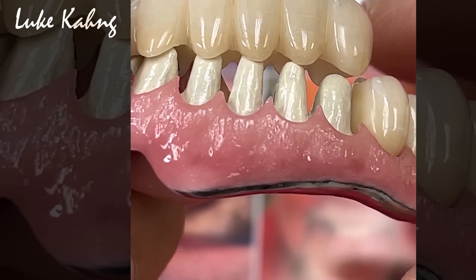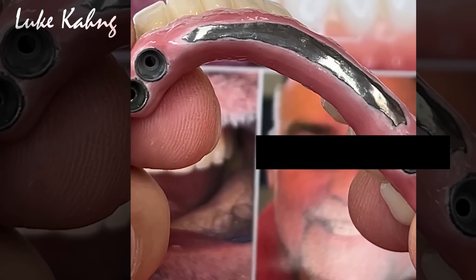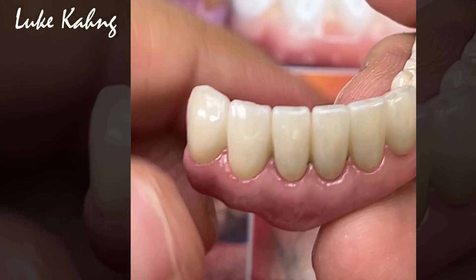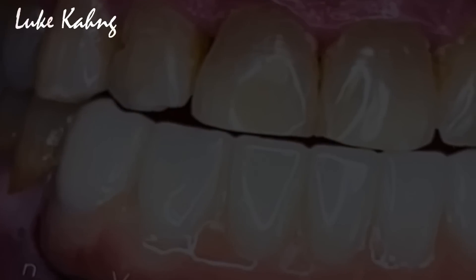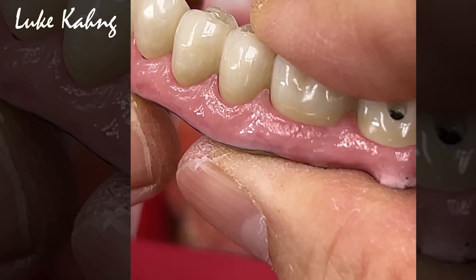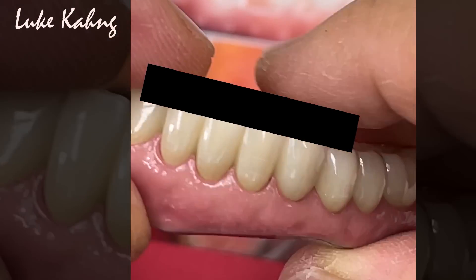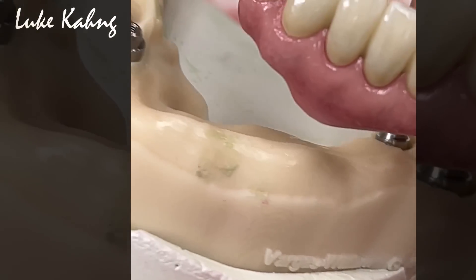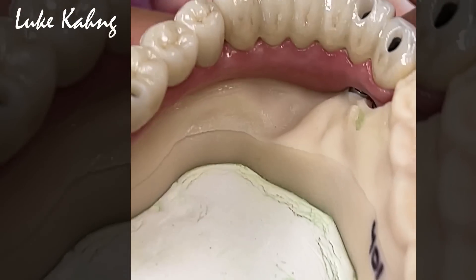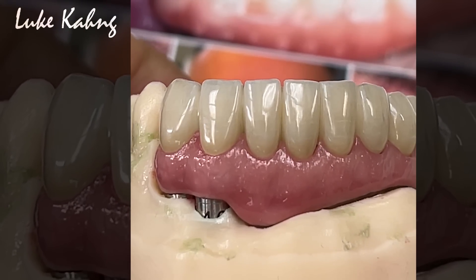This is a grand final case — exceptional hygiene. The long span implant cases are made as natural as possible. This is so cool — almost awesome.